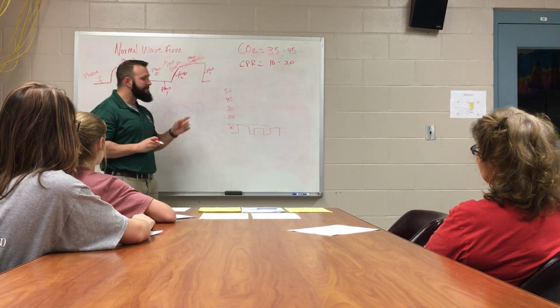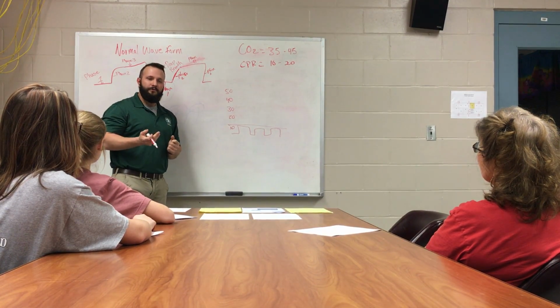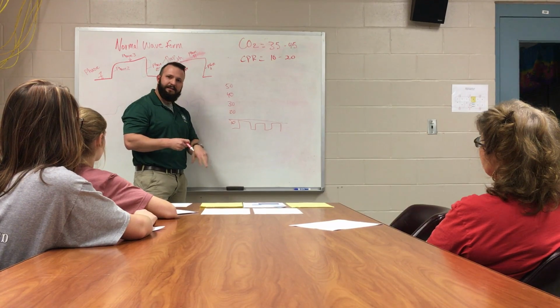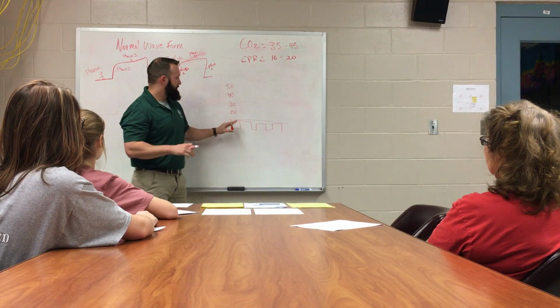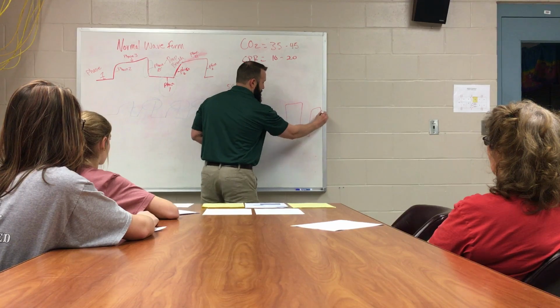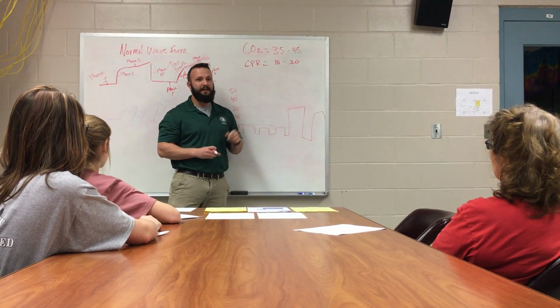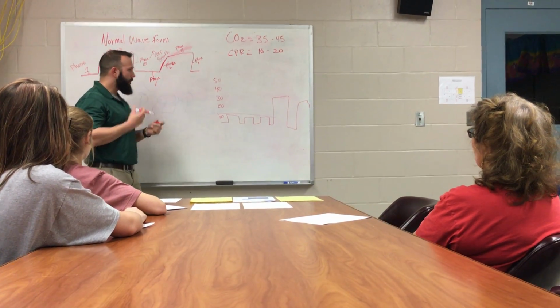Also, if we're doing CPR on our patient, it's always that weird thing of, do you feel a pulse? Because we all are doing CPR, our adrenaline's through the roof, our hearts are racing, and we go, I don't know, do you feel a pulse? We all kind of sit there for a second. This can help us with that. The reason is, let's say we're doing CPR at 10 to 15, then all of a sudden we have a huge spike. Well, I know good and well, I've been doing this for 20 minutes, I ain't doing this. There's only one thing that can do that. We have a heartbeat now. Your body's starting to work for you.